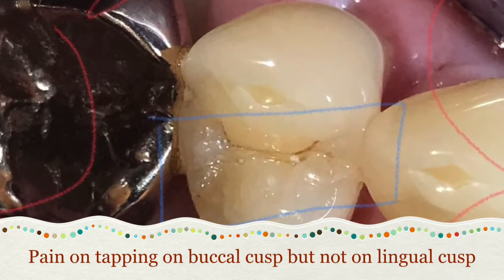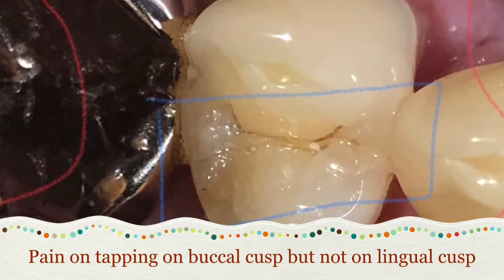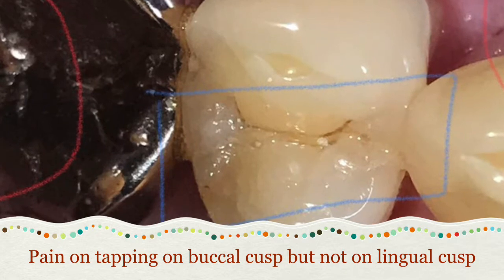Taking a closer view, you can now see there's a very tiny little crack right there.